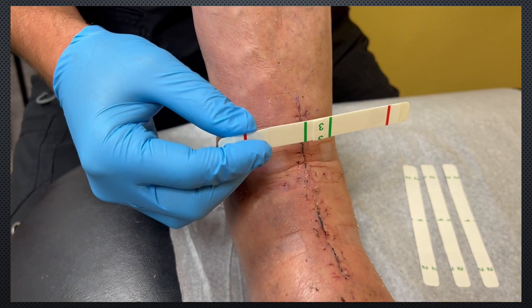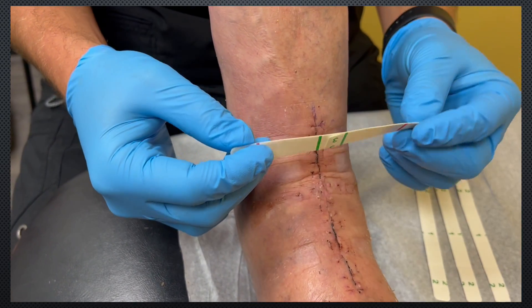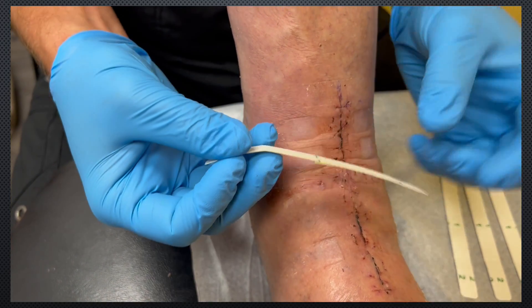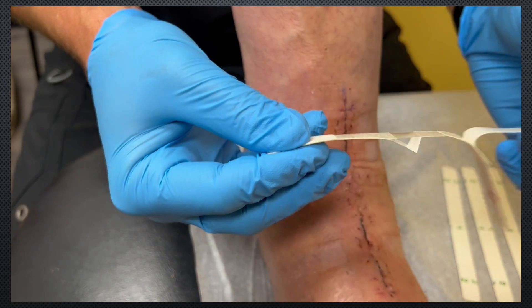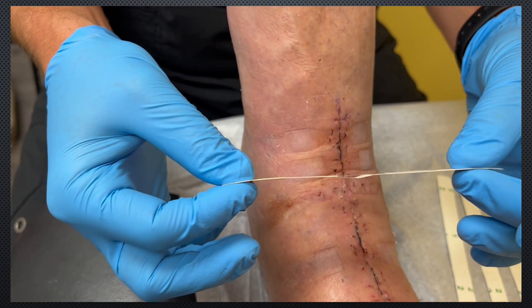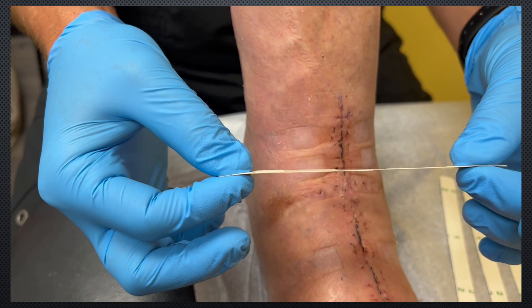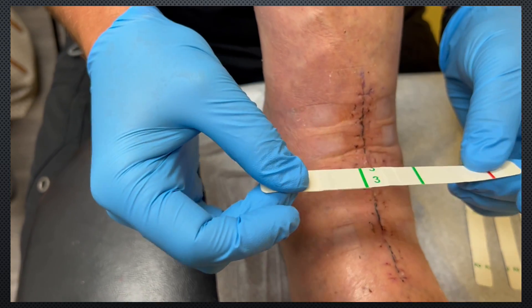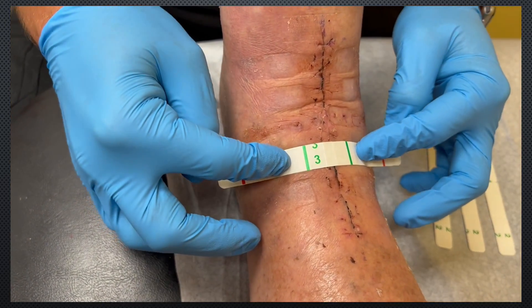Here are these non-invasive soft tissue expansion strips — I'll show you how to put these on. They're labeled 1, 2, and 3. First, take number 1 off. You see that it's got some elastic in the middle. You pull it out until that number 3 completely elongates, and then it stops you from over-tensioning it. So you pull it out all the way, and then just put it down — it's going to stick on either side.